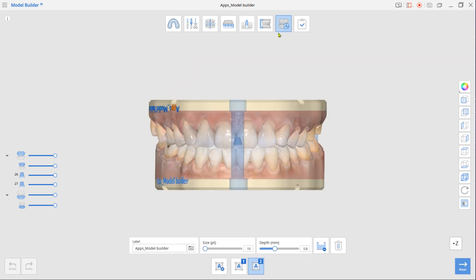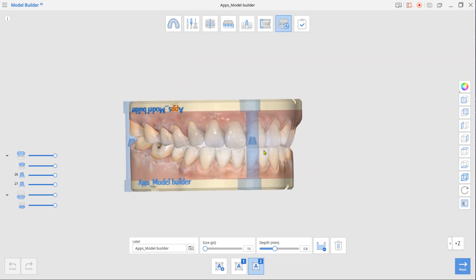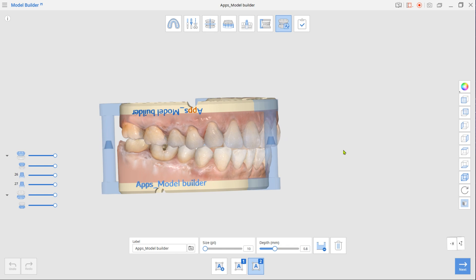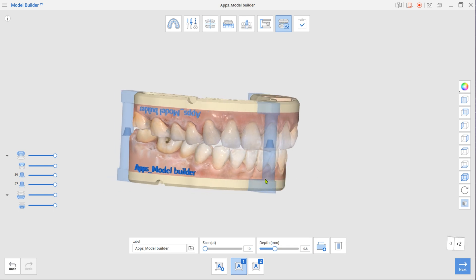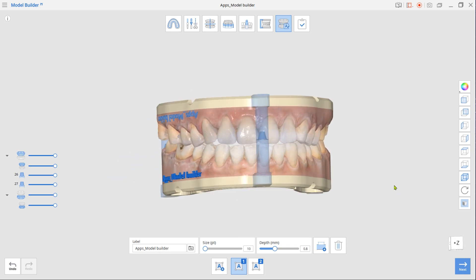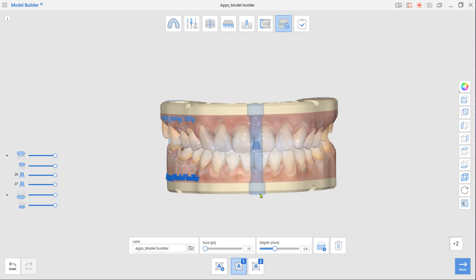Once done, move to the final labeling mode. The first label is automatically created using the case name. Drag the label to change its placement on the base. To change label text, enter a new name in the label box below. You can choose to engrave or emboss the label.